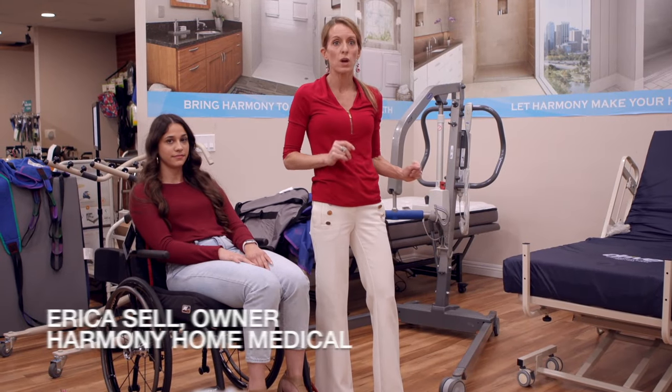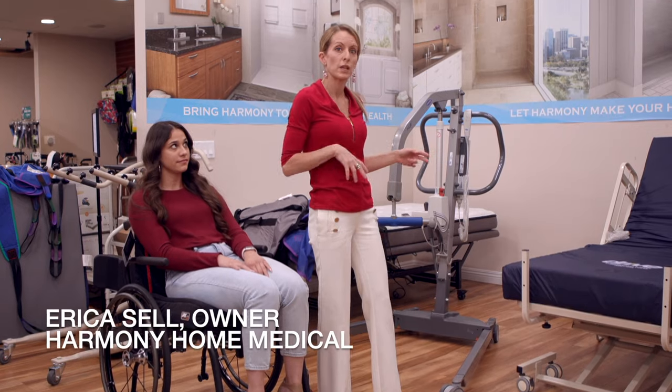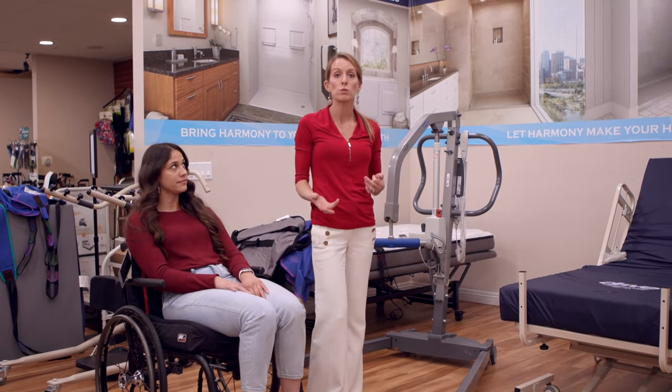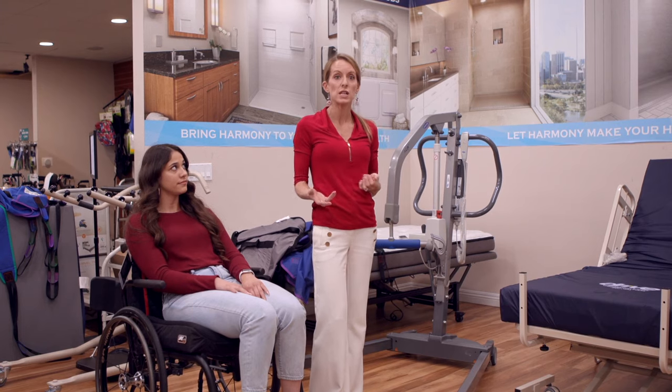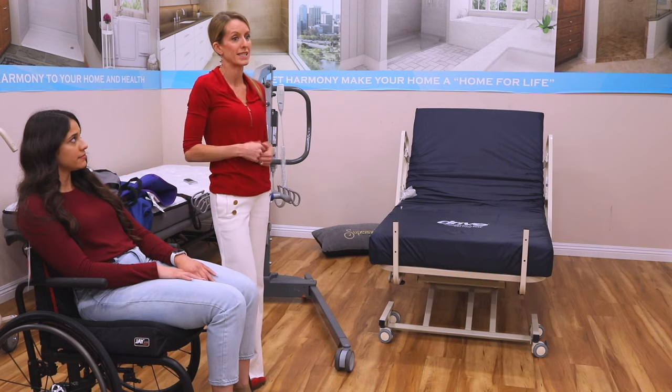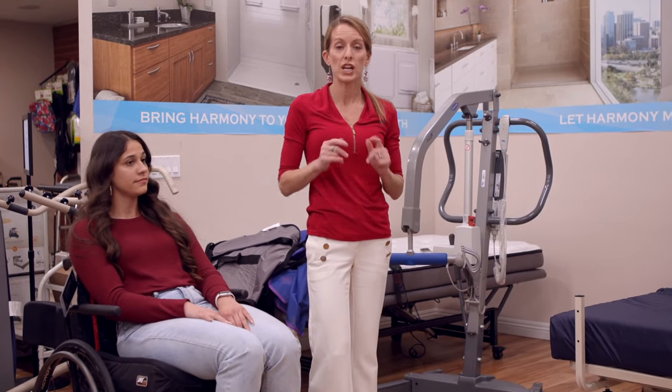There's one more I wanted to show, and this is going to be the one we're seeing in about 75% of homes and 75% of situations, because it's when someone needs a little more assistance than when they're doing a sit to stand. Let's check that one out.